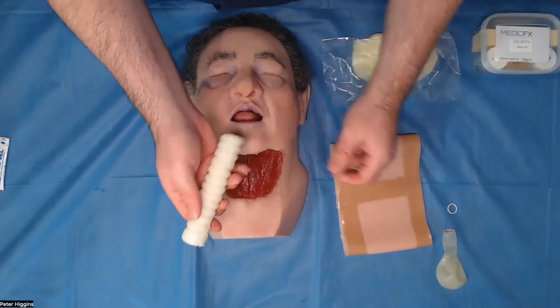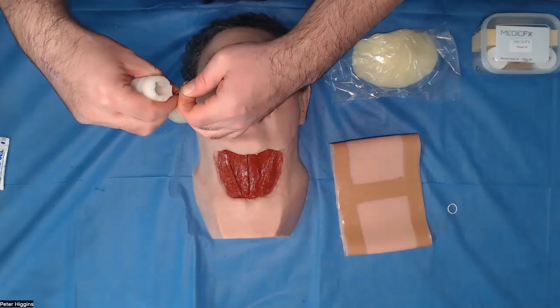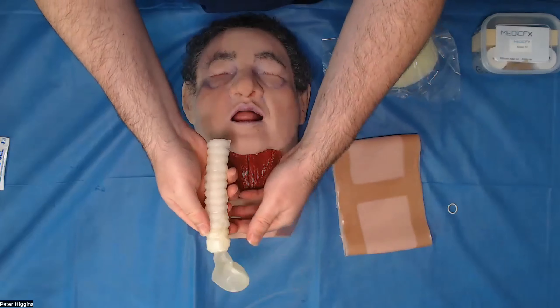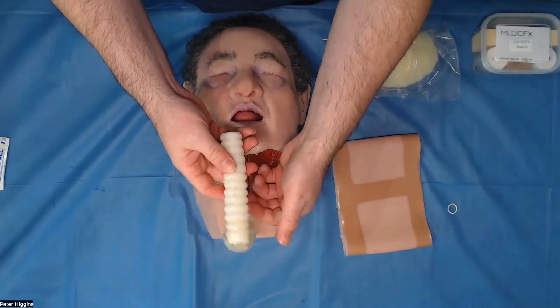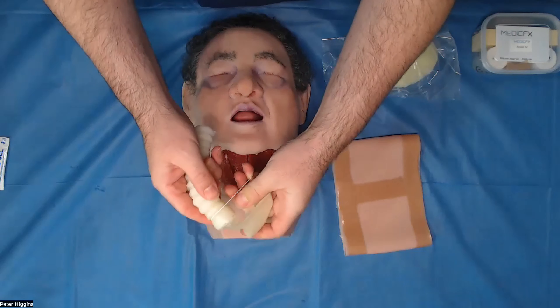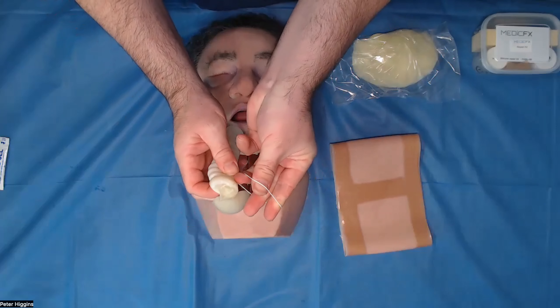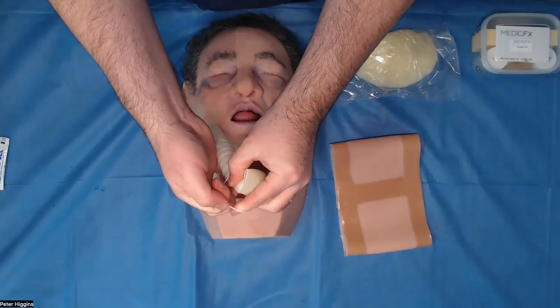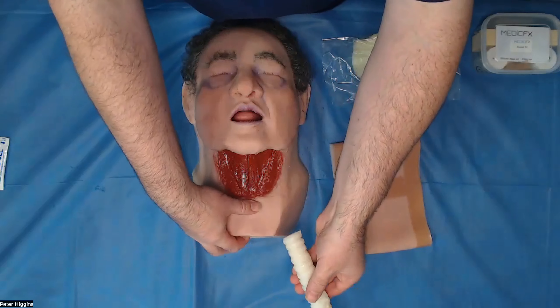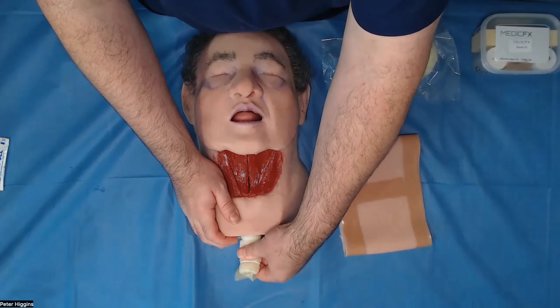Once your trachea is nice and lubricated, you'll need to take the balloon that's provided and stretch it over to the end of the trachea so that it just sits on the end. If you feel it needs it, just place the elastic band — pass the balloon through first, double it round, pass the balloon through again and then release. Now your balloon's inserted, we're going to place the trachea into the larger of the two holes at the top here.